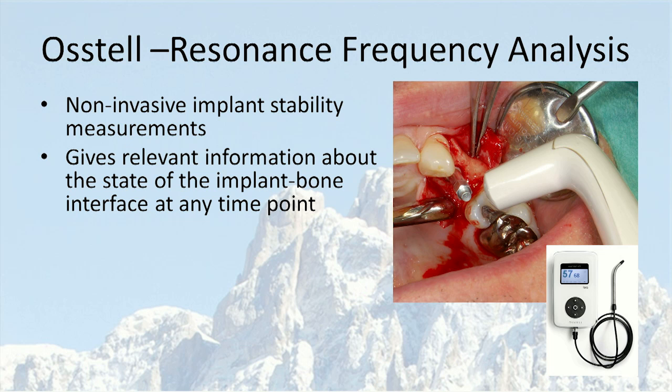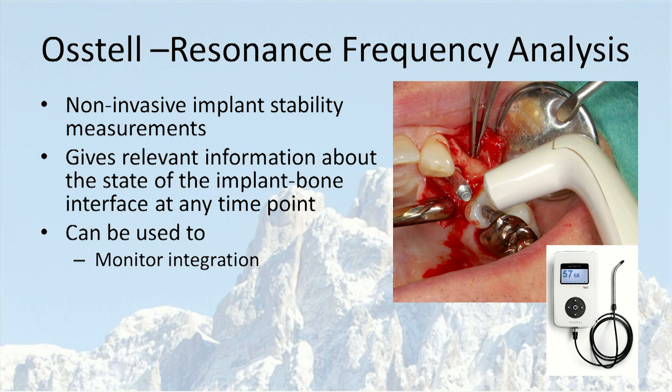The question is, what should we use the technique for? Can we use it for something? Well, we can use it to monitor integration, as we will beautifully see in the coming presentations. We can use it to decide when to load our implants. We can use it to avoid failures. And finally, we can also use it to diagnose old cases that come back to your office.